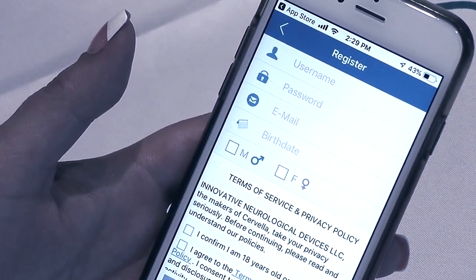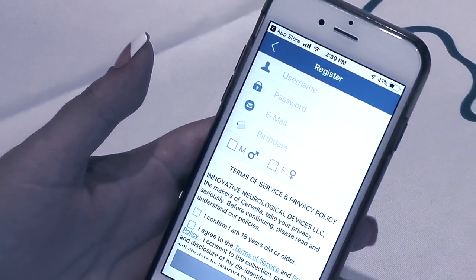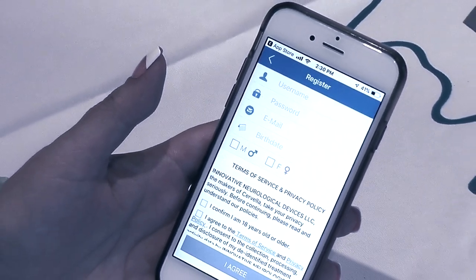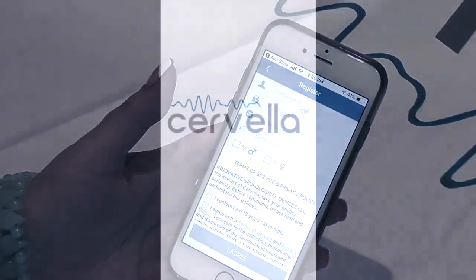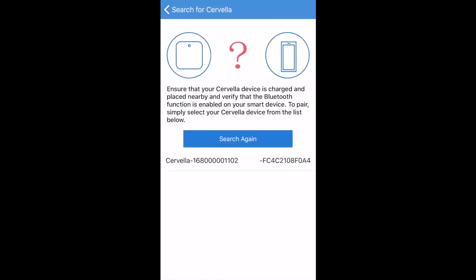Once you have successfully installed the Cervella app, completed the registration process, and the Cervella device and headset are both charged, we can proceed. Start the Cervella app and tap 'Touch to Connect,' or select pairing from the drop-down menu and press 'Search for Cervella' to enter the pairing process.